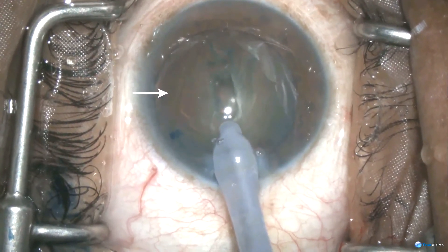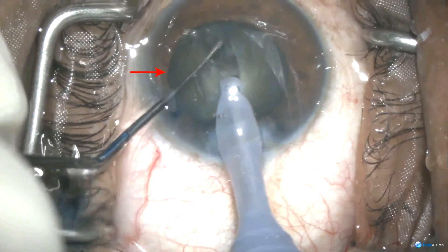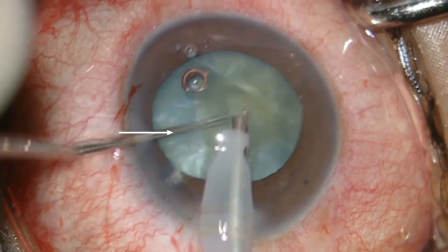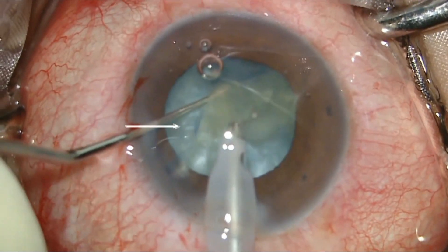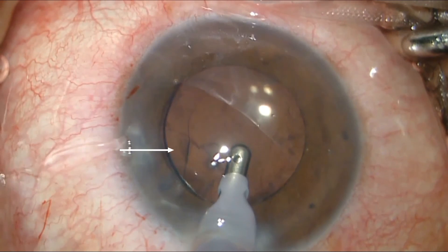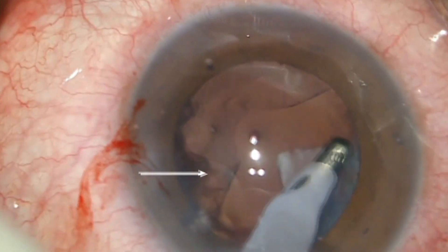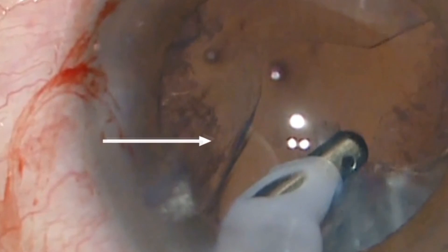The flap motility sign, unlike the classical signs of PCR, appears instantly. It helps surgeons of varied expertise to know the endpoint of safe phacoemulsification, thereby reducing complications. With recognition of the flap motility sign, since we can appreciate the extent of the tear, we can be decisive about continuing phacoemulsification or converting. The knowledge of the flap motility sign helps the surgeon to conclusively decide about the safety of intraocular lens implantation in the bag. The new surgical gaze makes all the difference in surgical experience in the presence of an anterior capsular tear.